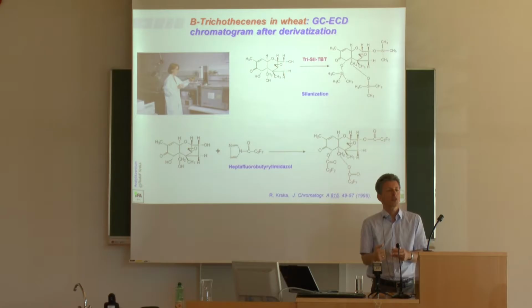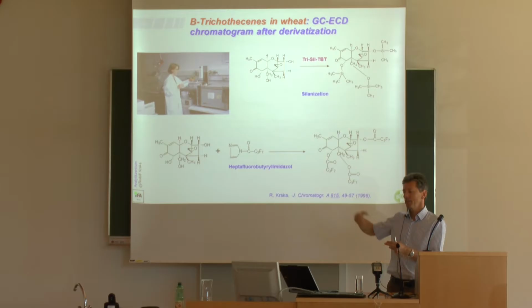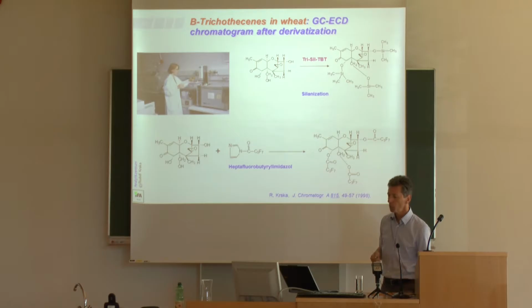So also your background noise will increase because all the other components which you are not interested to detect will be fluorinated and thus give you actually an increased background noise.